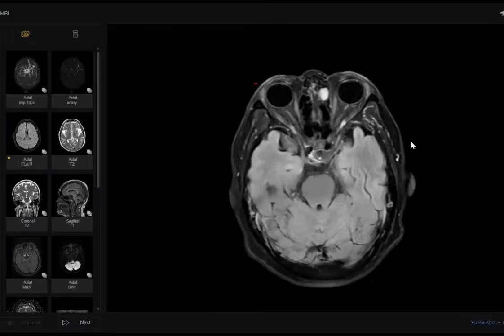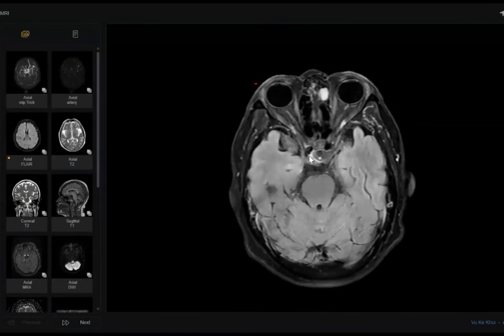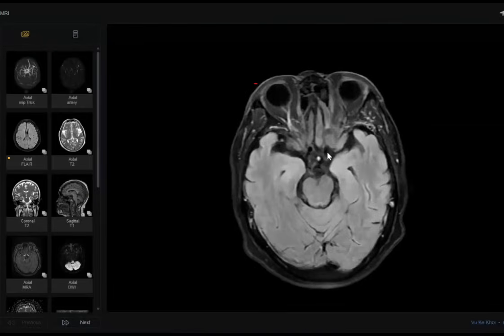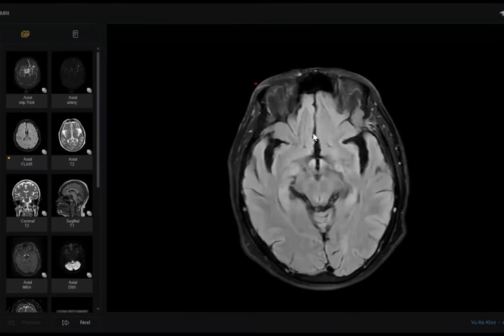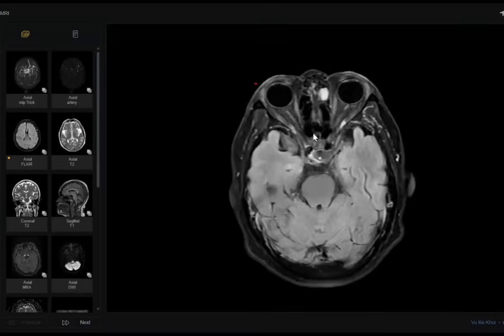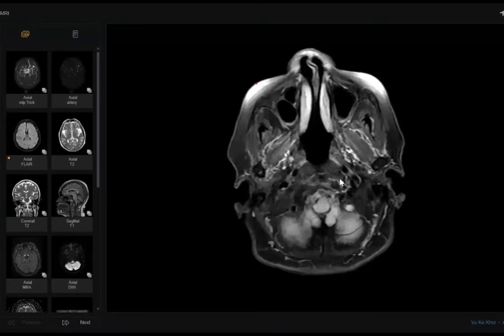Or the patient has aneurysmal dilatation, either in the Sylvian fissure related to the MCA, or in the circle of Willis, or here in the interhemispheric fissure related to the ACA. This is another point. Number three, take care of the vertebral arteries.